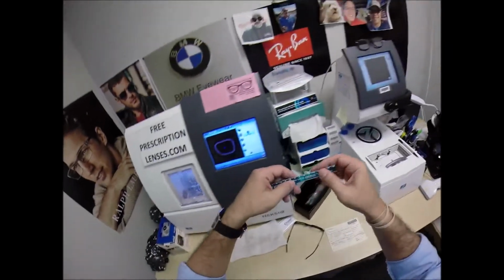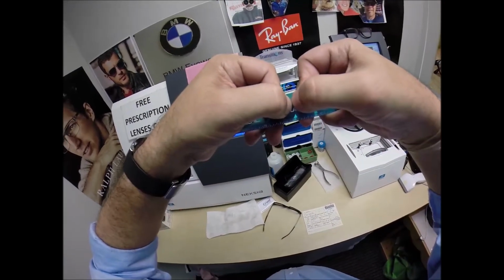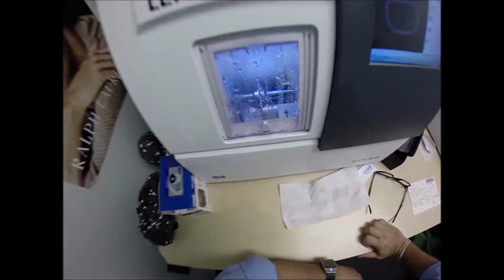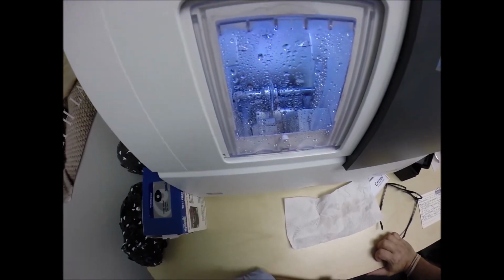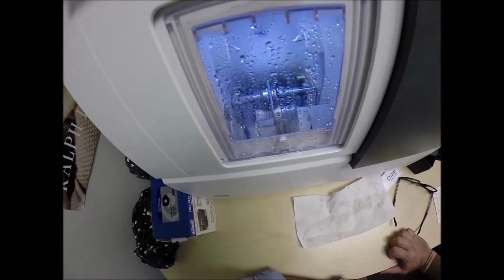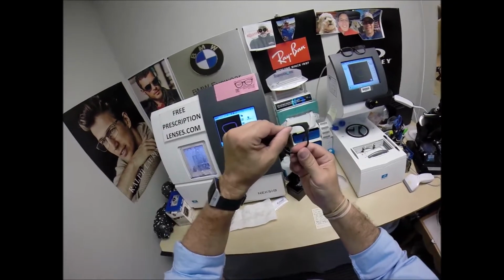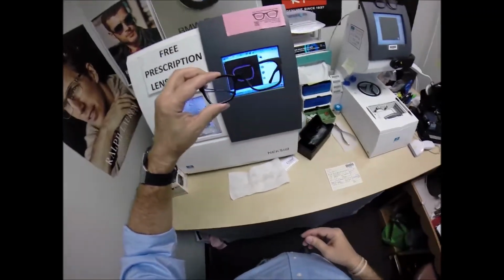A tenth of a millimeter, to all my American friends who have no idea what a millimeter is, it is the distance between my thumbnails. I'm going to take 1/10 of that off, going around the circumference of the lens until it snaps in there easily. The reason why I want to do that is if I were to force the lens into the frame, it would cause the frame to stretch, or what we in the optical industry call roll.